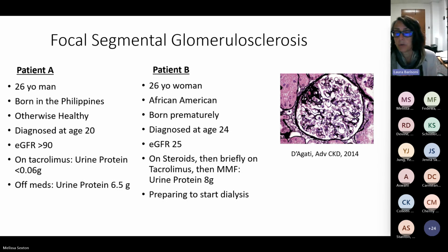Why is pathology important? Because in reality, we don't know much about it yet. And the way we have been doing pathology using conventional diagnosis really doesn't explain the biology behind the diseases and how the structural changes happen in the kidney. For example, this lesion that you see here is a lesion of focal segmental glomerulosclerosis. But by itself it doesn't say anything. In fact, this can be present in patient A as well as in patient B. It can be exactly the same.